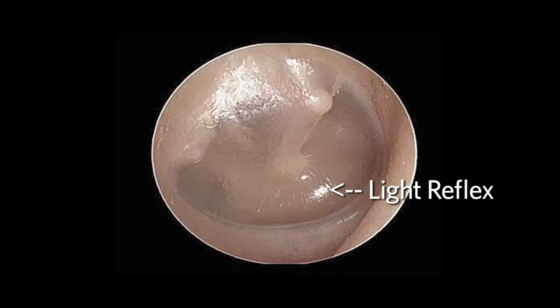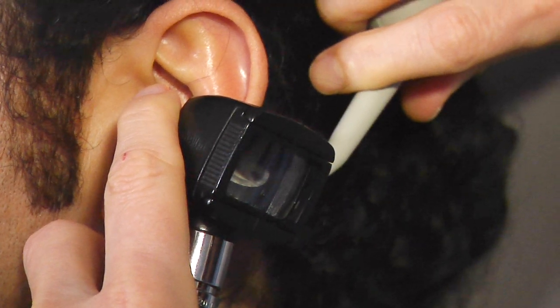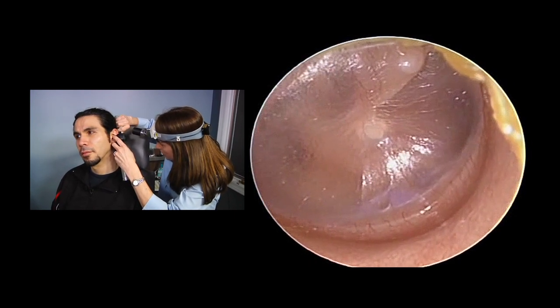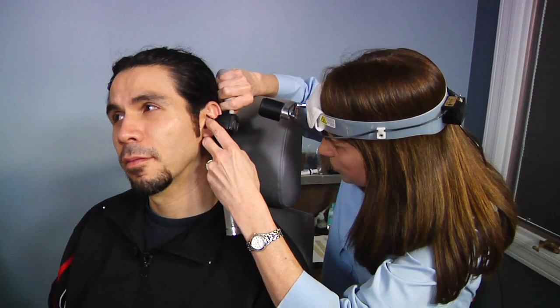The light reflex is important in evaluating pneumatic otoscopy for the mobility of the tympanic membrane. Now I'm going to assess the tympanic membrane mobility by puffing some air into your ear canal and checking the movement of the tympanic membrane as I do that. This needs to be done and documented on every pediatric patient and accomplished on every adult whenever possible. In the pediatric patient, the tympanic membrane may appear to be normal but have no mobility, suggesting the presence of an effusion in the middle ear.